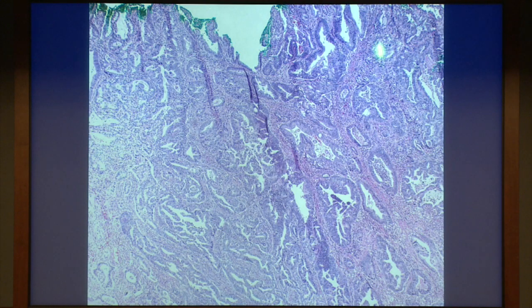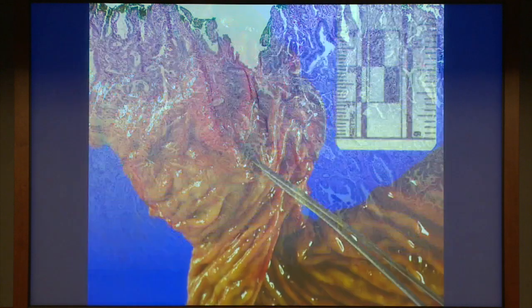Under the microscope, cholangiocarcinoma looks field for field like pancreatic adenocarcinoma. There really are no distinguishing features and very little on any special stains or anything we could do to tell the difference. So that's why we have to put a lot on a very careful gross examination.